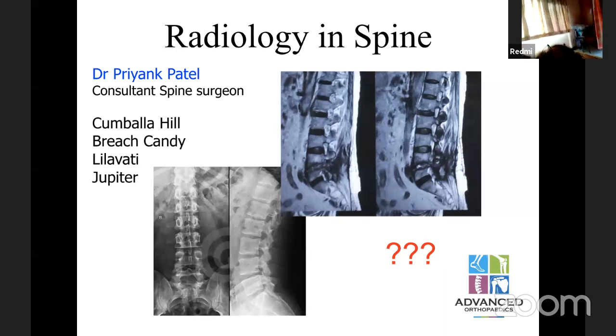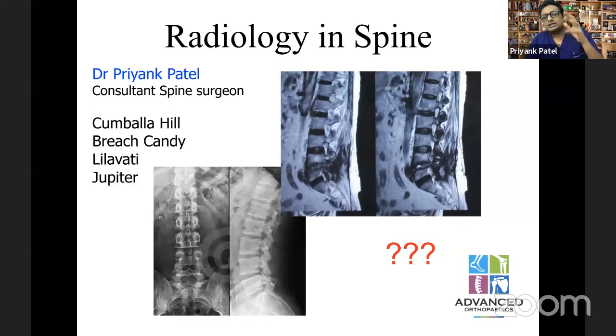So the different areas of the spine pick up magnetic rays differently, and then they give it out, which is caught by gantries, and then you get certain images. So two specific images that you get are the T1 weighted image and the T2 weighted image, around which all MRIs of all parts of the body are discussed.